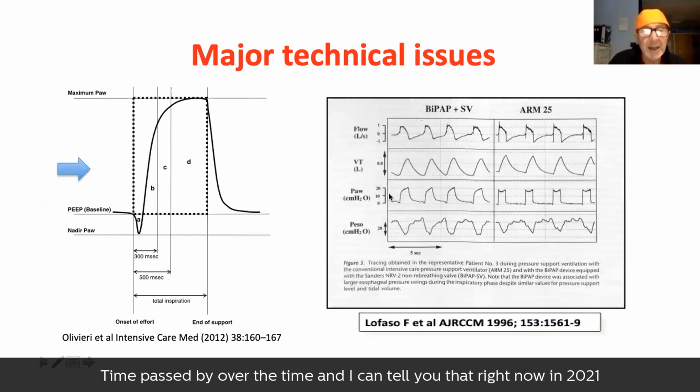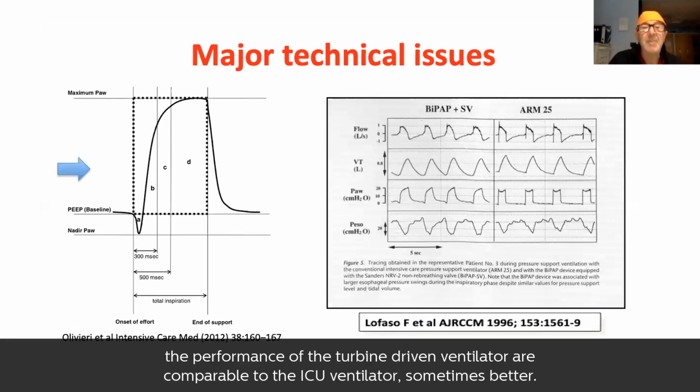Time passed by, and I can tell you that right now, in 2021, the performance of the turbine-driven ventilators are comparable to the ICU ventilator, sometimes better.